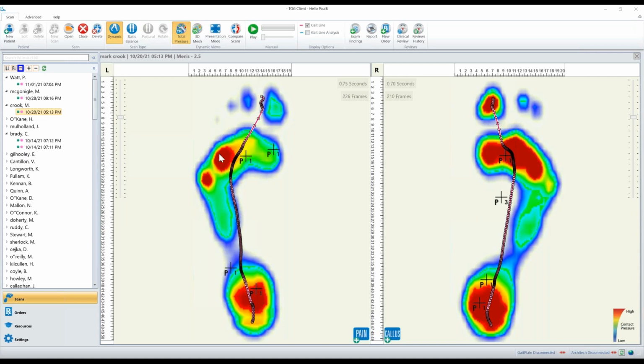This is a classic position to have a Morton's neuroma. So when you see this happening, that should be a flag to think, test for that. Morton's neuroma, do a Mulder's click. You should look at that. You should test the lateral ligament complex. If somebody's very laterally rotated, I would always do some proprioception, some balance work, and check their ATFL and check their sinus tarsi.